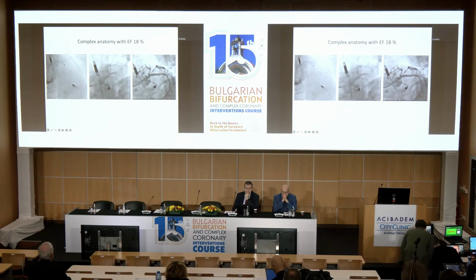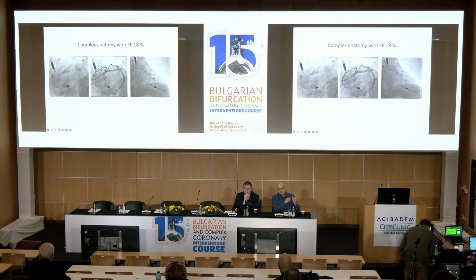And then finally we stented here, it was a Megatron stent, a stent with very good radial force and dedicated for calcified lesions and left main. So finally we could go here with triple kissing, as shown here, and a drug-coated balloon for the proximal LAD.